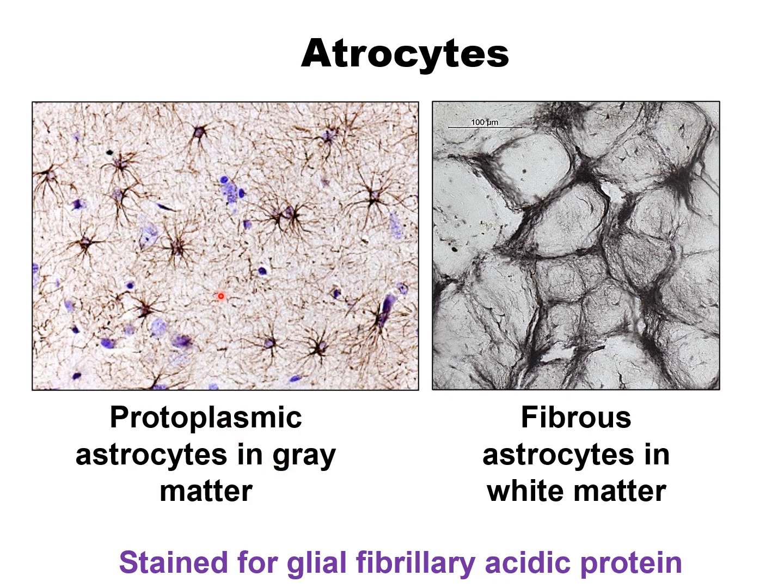If it is stained by some antibodies, then the fibers can be seen. So there are two types of astrocytes one can see, the protoplasmic astrocytes and fibrous astrocytes. This is the protoplasmic astrocyte in the gray matter of the cerebral cortex, stained by glial fibrillary acidic protein, and the fibrous astrocytes are present in the white matter. The largest white matter is corpus callosum.